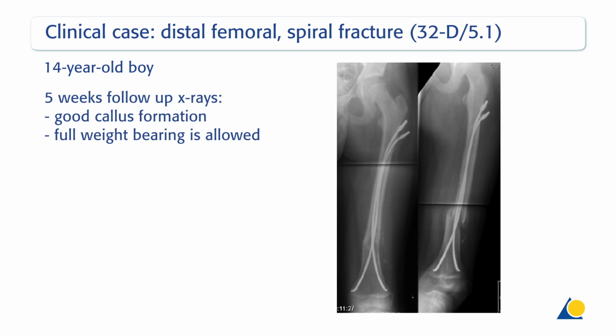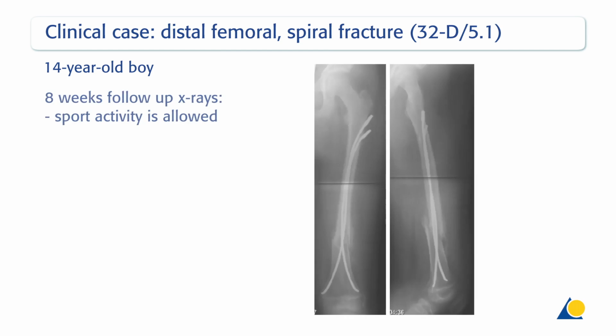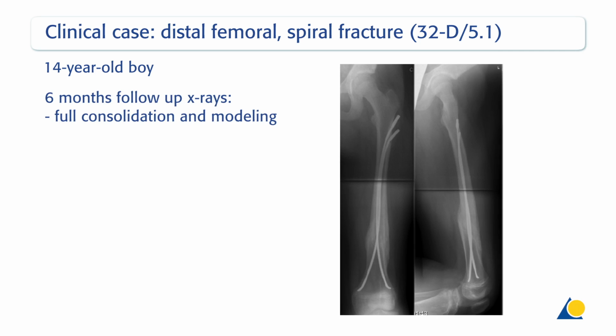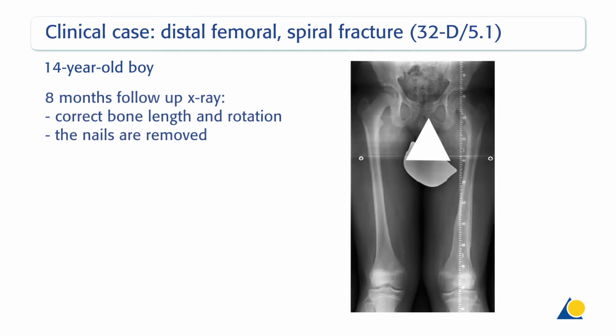The 5 weeks postoperative X-rays show good callus formation, and full weight bearing is allowed. Sport is allowed 8 weeks postoperatively. The 6 months postoperative X-rays show full consolidation and modelling. The 8 months postoperative X-ray shows correct bone length and rotation after the nails are removed.